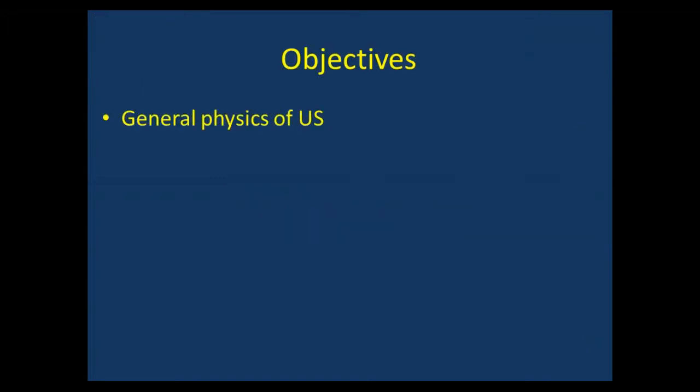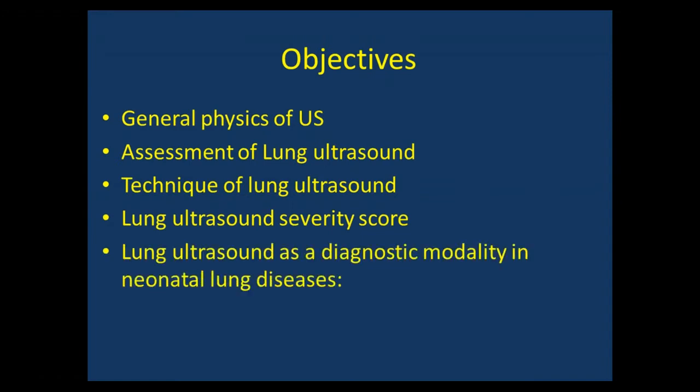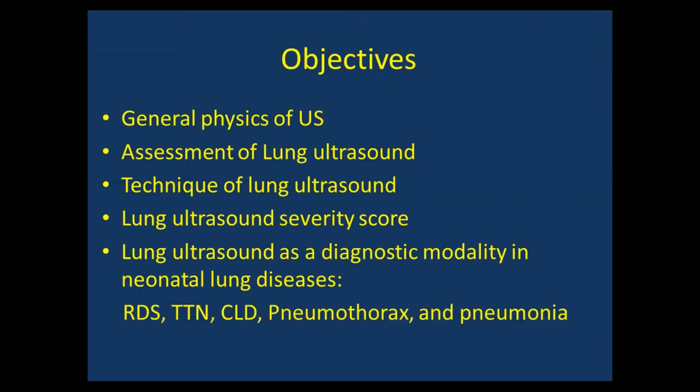My objectives: to discuss general physics of ultrasound, assessment of lung ultrasound, the technique of lung ultrasound, lung ultrasound severity score, lung ultrasound as a diagnostic modality in neonatal lung diseases, including RDS, TTN, chronic lung disease, pneumothorax, and pneumonia.